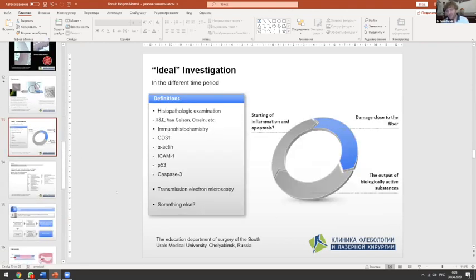because it's impossible to organize an ideal investigation and to find these best settings in the clinical part, because we already have a very low pain syndrome. Our median pain level was zero, approximately zero. So you need so many patients to find a difference between different settings. This is the biggest disadvantage of all of this.